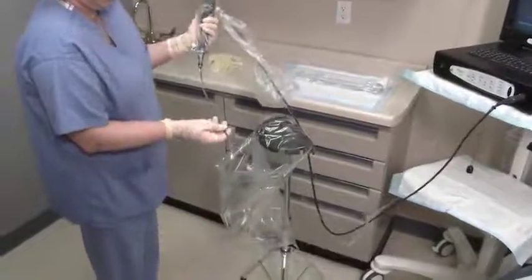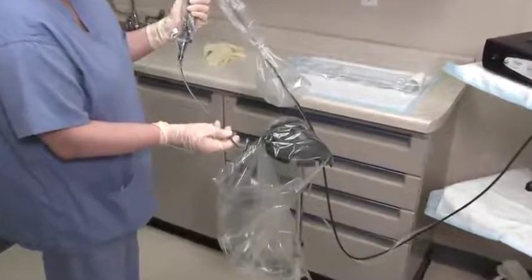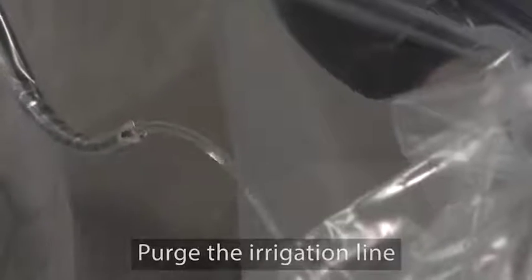The cystoscope is now ready for use. Lift the system out of the installation stand. Visually inspect the sheath to make sure that the distal tip of the cystoscope is flush with the sheath window. Activate the flow control valve to ensure proper operation of the fluid irrigation.